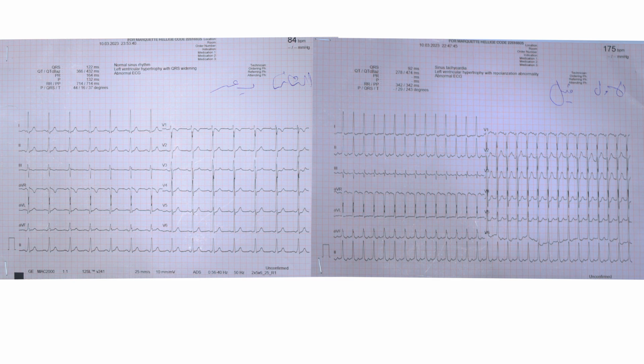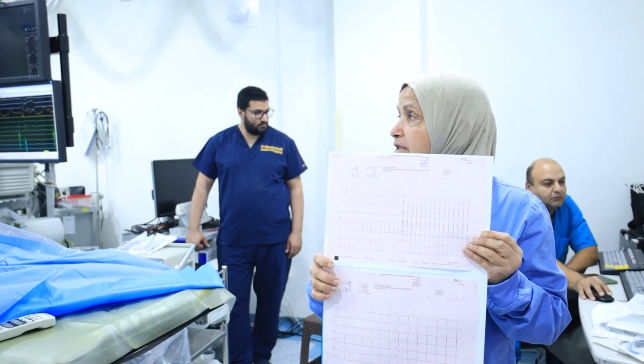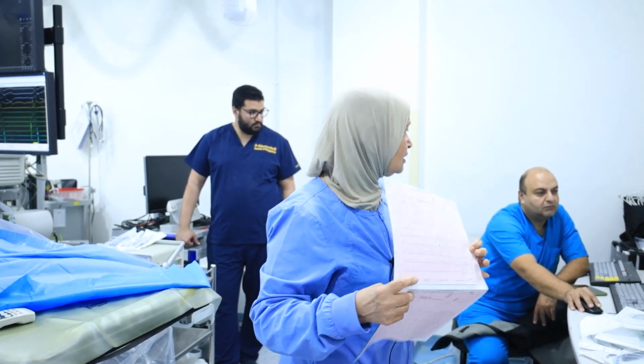So we changed the plan. We said we are not going to do it with 3D, although we have everything ready, but we are going to do the basic EP study in the beginning, with the suspicion that it might be a left lateral accessory pathway. We'll go to the EP.